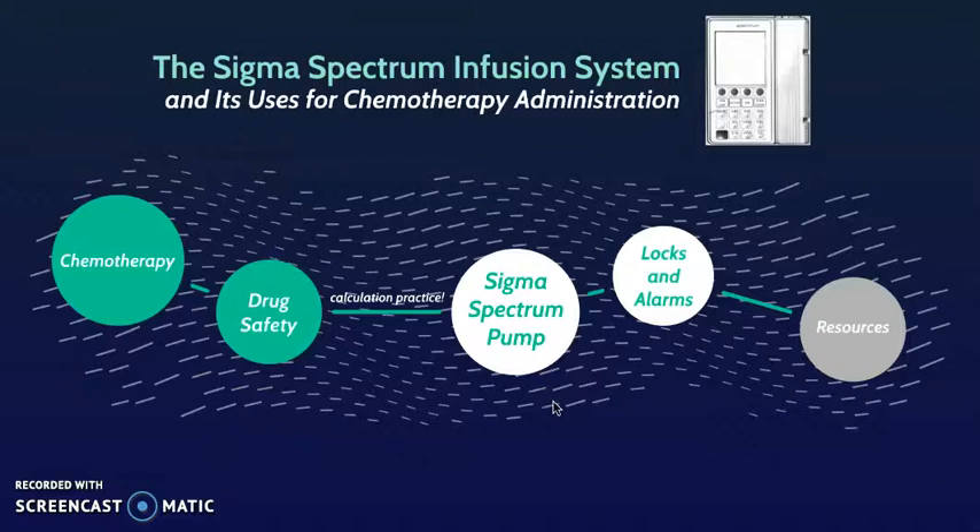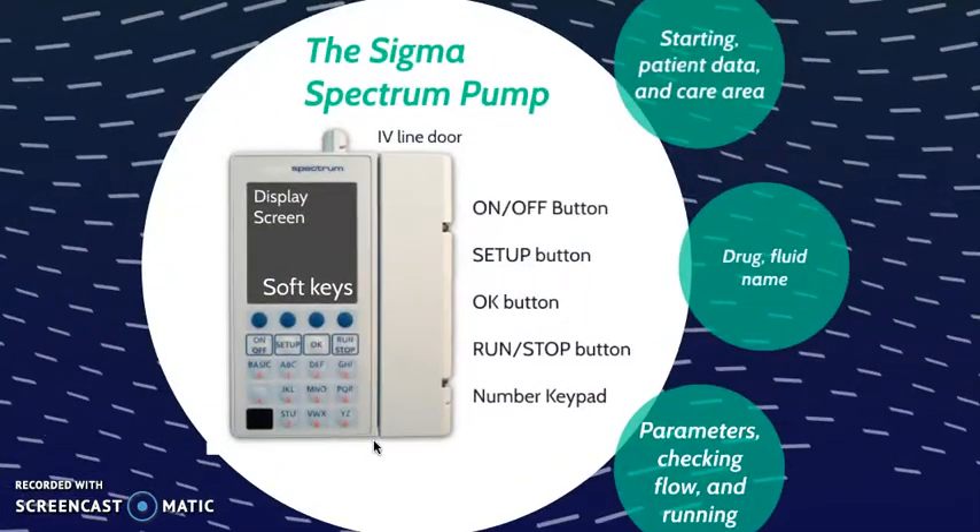Let's take a quick look at the pump itself. From the image you can see the pump and all of its parts. I did want to highlight a few key components: here's the display screen where you'll see many of your prompts, here are the soft keys to toggle between your choices, here's the IV Line door, and here's the keypad and all the buttons. The screen will guide you when those buttons are necessary.